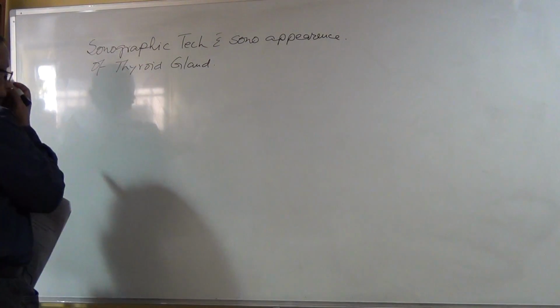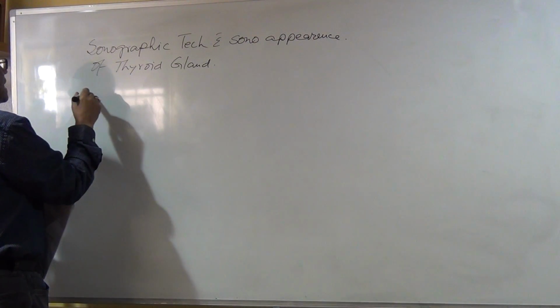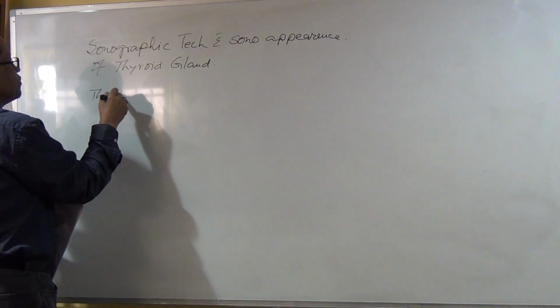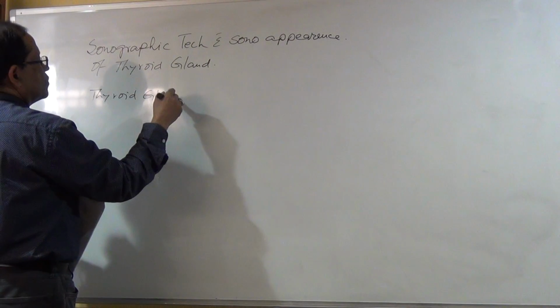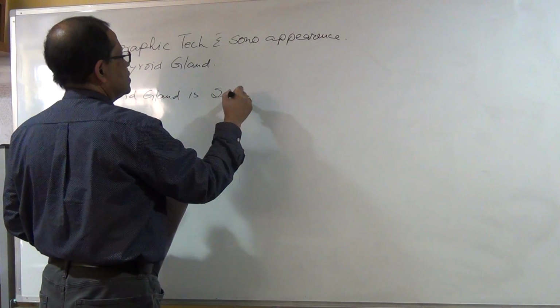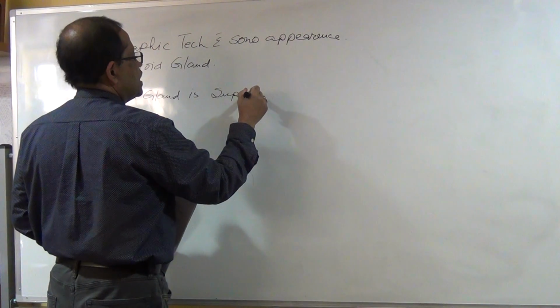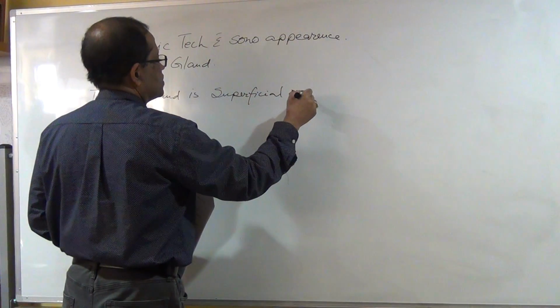Sonographic technique: we have to understand the thyroid gland is a superficial organ.